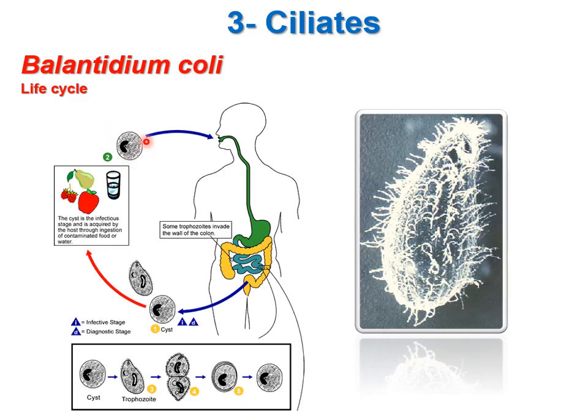As a typical intestinal protozoan, the way of infection is by ingesting cysts in contaminated food or water, excystation within the digestive tract, and multiplication of the trophozoite stages by binary fission. Within the stool, we will have the two forms: the cyst, which is the more resistant and the main transmission form of the parasite, and in freshly isolated stool the trophozoites, which are very characterized by the cilia that surround them.